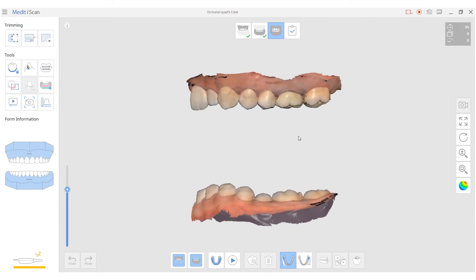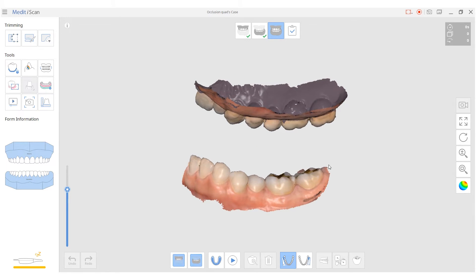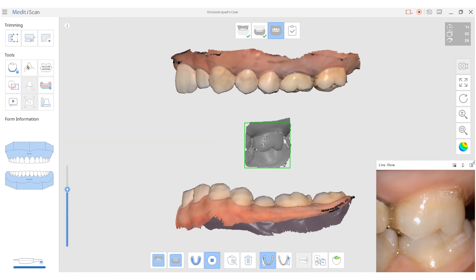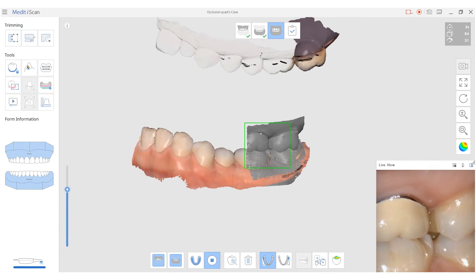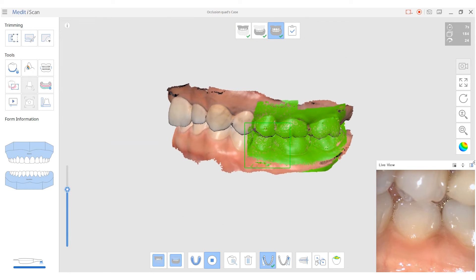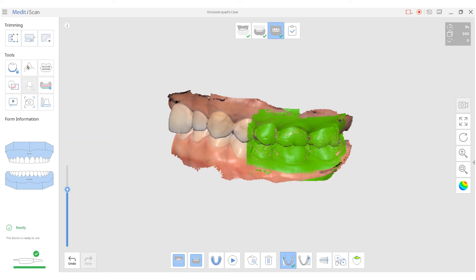There are many cases where a clinic may want to only capture a quadrant. Just like a full arch case, approximately six to eight teeth should be scanned up and down in a vertical motion from the posterior molar. If the patient has missing teeth, the retained teeth should be scanned for the bite registration. If there is too much missing tooth data, it is advised to scan the full arch to get the bite.